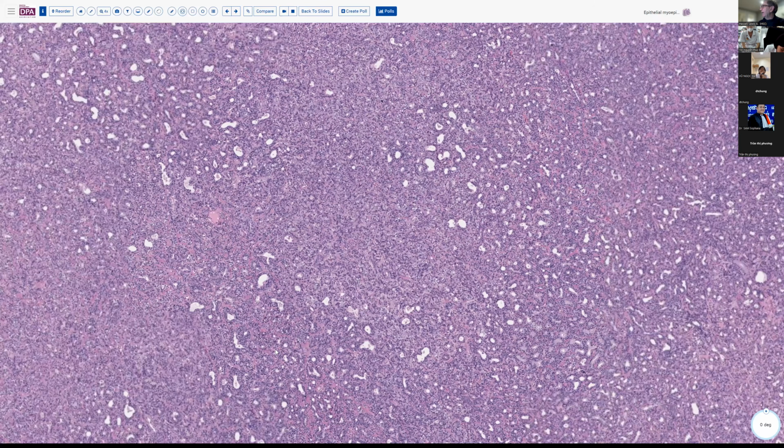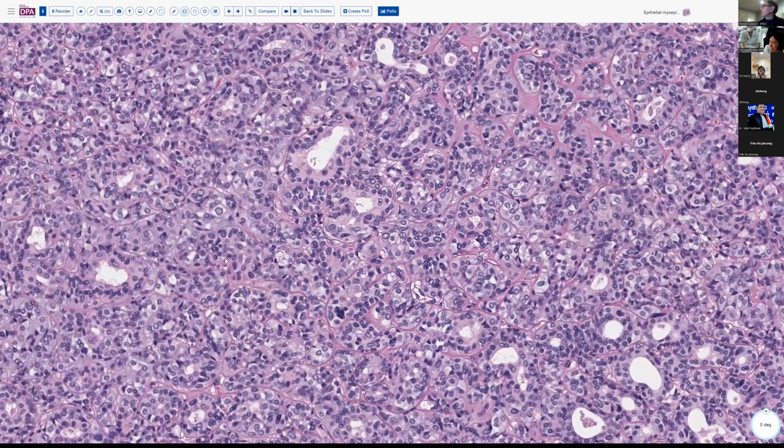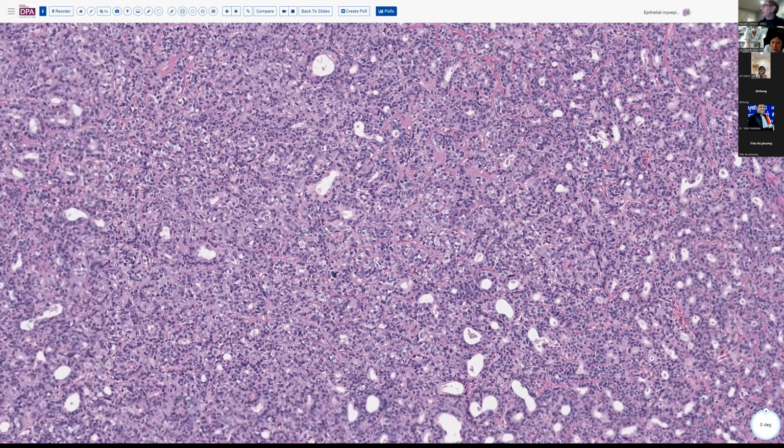And so this is a combination tumor, if you will, where most likely the myoepithelial component is going to be the more concerning one. So here's a ductal element, and then you have a hard time telling which of these are myoepithelial and which are going to be epithelial cells, which is where your immunohistochemical stains would be helpful.